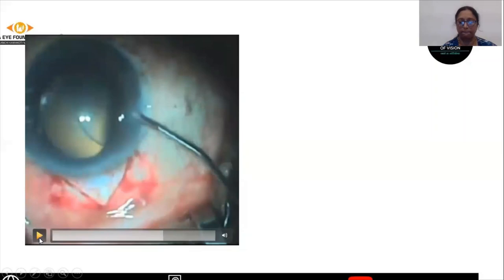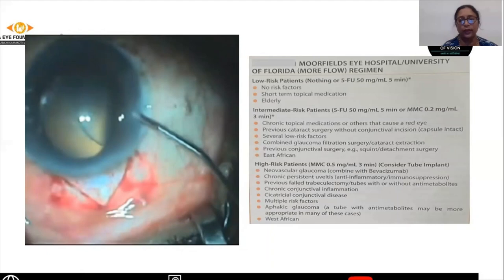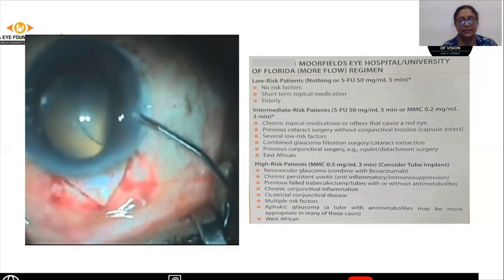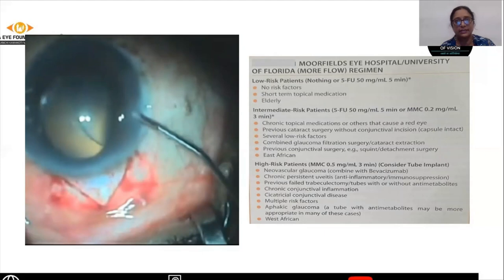At this stage, we need to apply the mitomycin C following the Moorfields regimen depending upon the risk of the patient. For low-risk patients, you can do away with mitomycin C, but generally today all cases get mitomycin C application. For intermediate-risk patients, you can use mitomycin C 0.2 milligrams per ml for 2 to 3 minutes. In high-risk patients, you can either consider a tube implant or mitomycin C can be applied at 0.4 to 0.5 milligrams per ml for about 3 to 5 minutes.